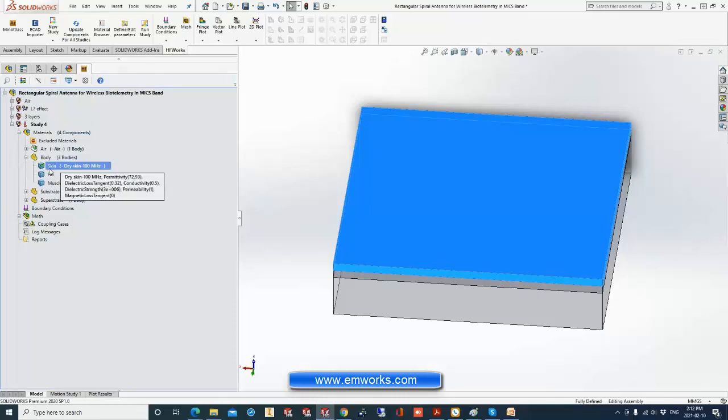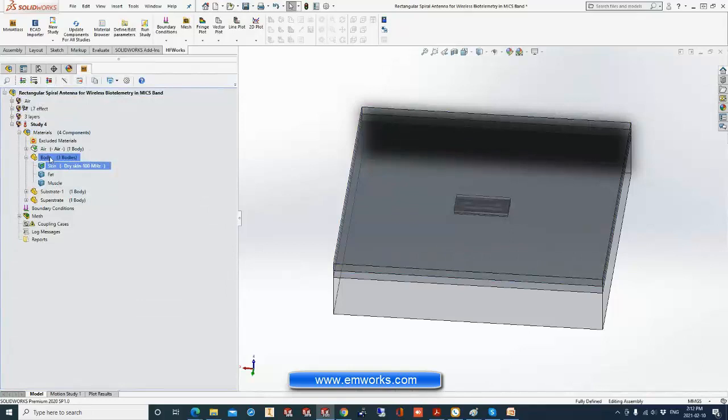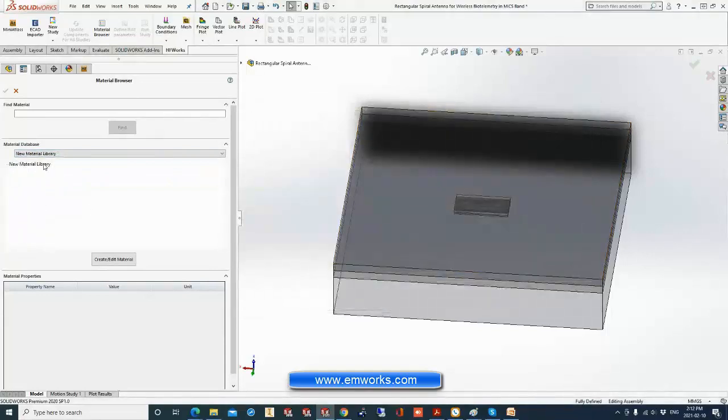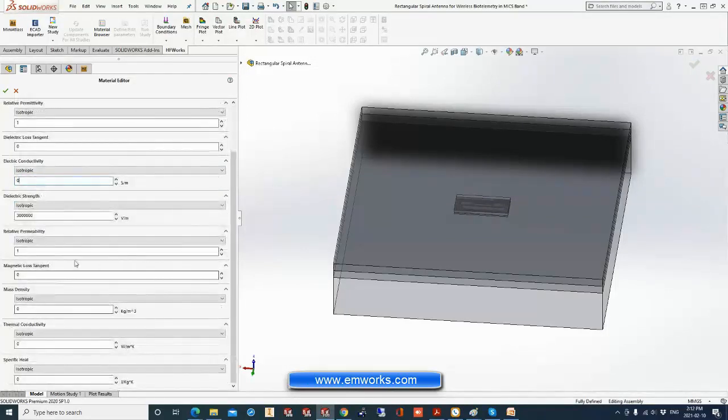Also, if you want to adjust any parameter, you simply edit the material and you will get access here to adjust any parameter. If you want to use your own material later for other projects, you can apply material and, instead of using HFWorks material, create your own material. You can load existing material, or for example create a new library, and inside this library define a new folder, a new category and a new material here, and enter manually the different parameters such as the permittivity, loss tangent, the electric conductivity, or any other parameter.